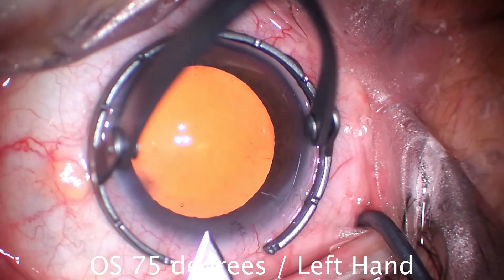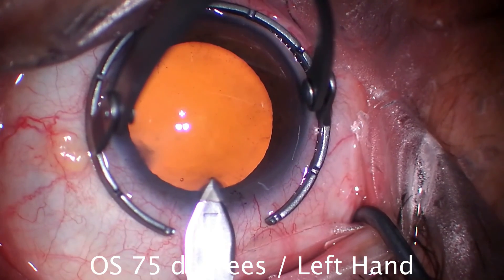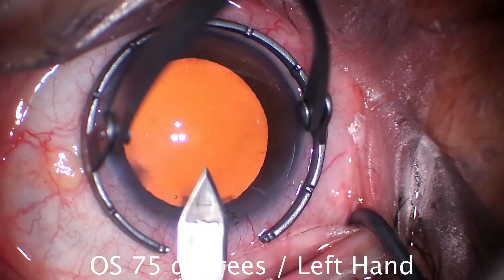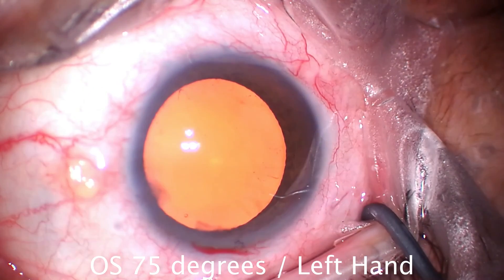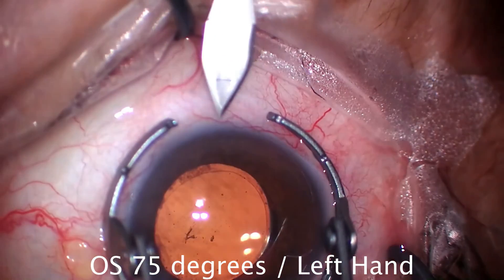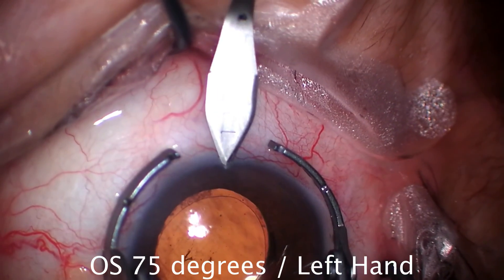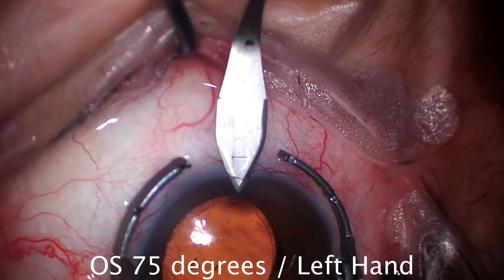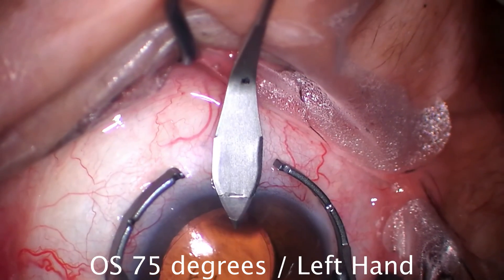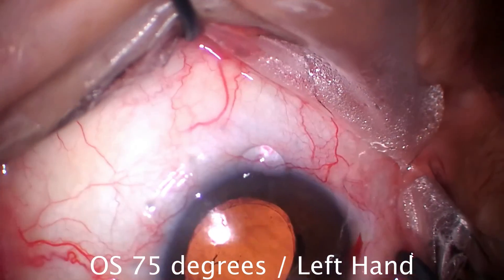Here's another example at 75 degrees — it's a left eye, and to do this I switched to my left hand. I'm able to make the entire surgery with my right or left hand, so we make the phaco incision here with the left hand at 75 degrees, sitting superiorly. At the end of this same case, we make a paired incision. I switched hands because we're operating at a very unusual angle inferiorly — this incision is not used for surgery itself, just to help correct the astigmatism.